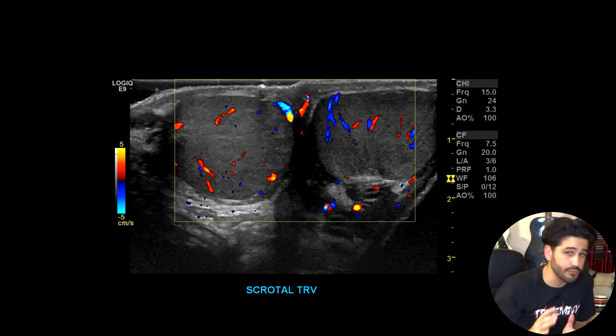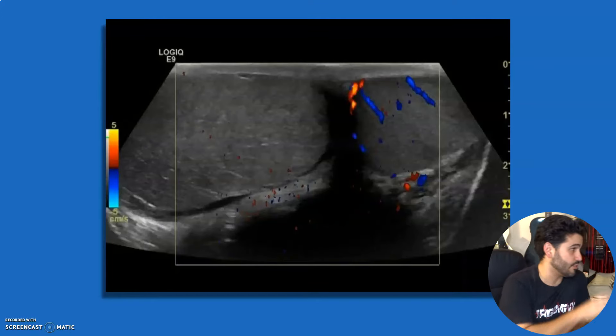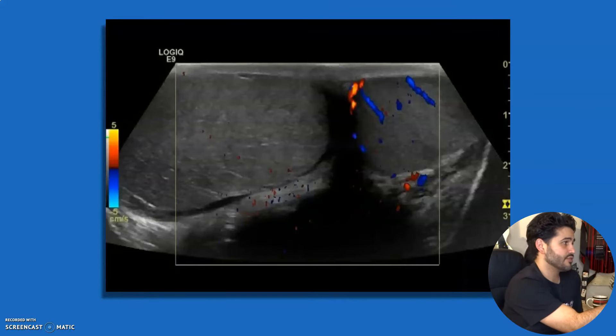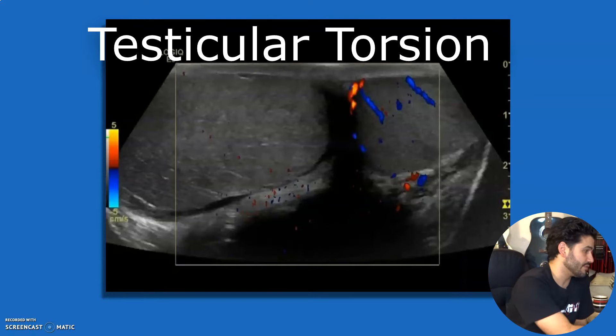There's no testicles lacking color flow, which is also good — you don't want testicular torsion. That's pretty much the number one reason to do a testicular ultrasound, at least in the ER. In this next example, you can see a transverse view of the scrotum: one testicle has color flow, the other testicle is turned sideways — longitudinal — and that one has no flow. That's a case of testicular torsion.